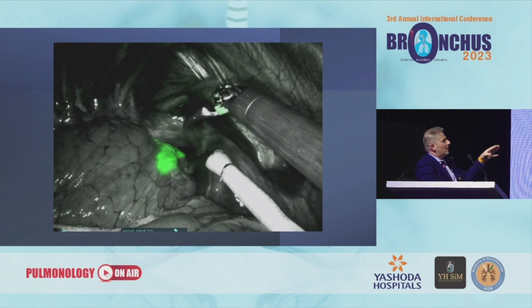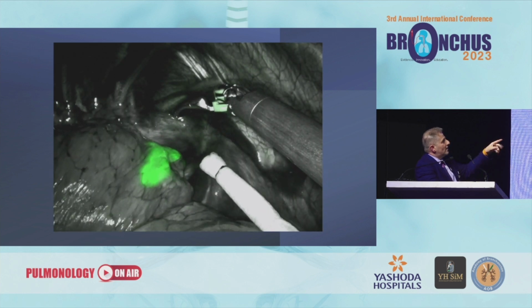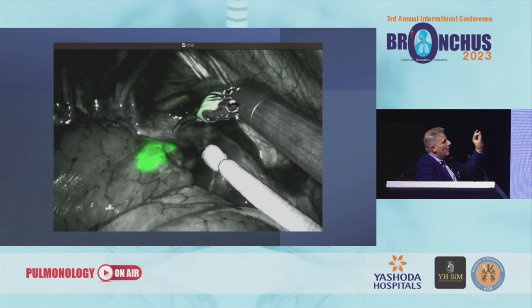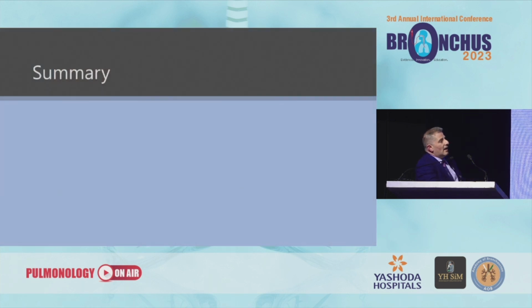Then turning the patient and going for the surgery, you can see here with the Firefly light, that segment is really very clear where the lesion is, and there is where the surgery was done.